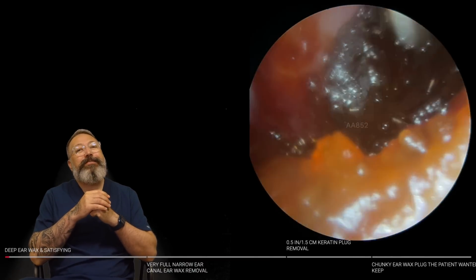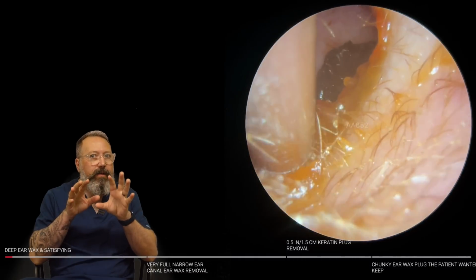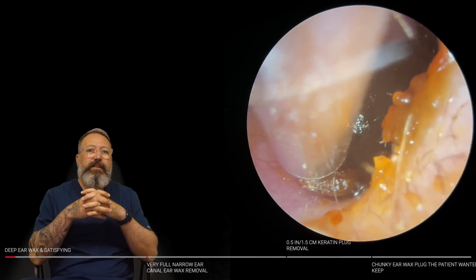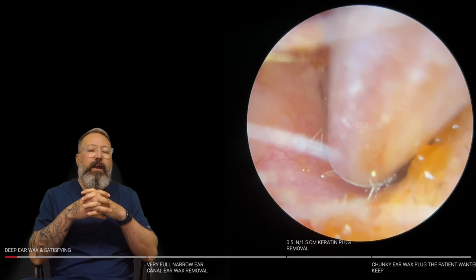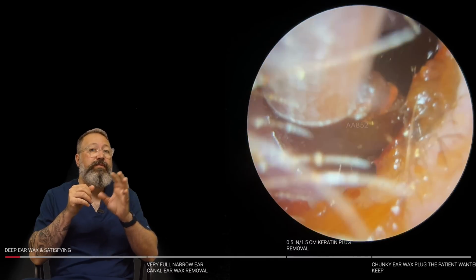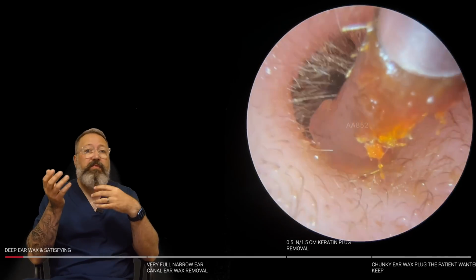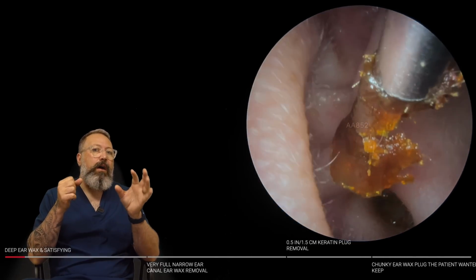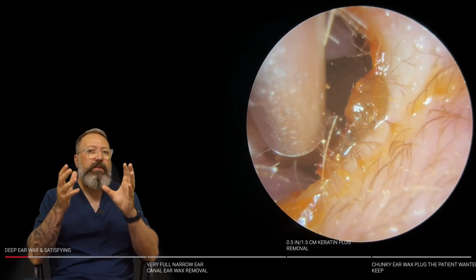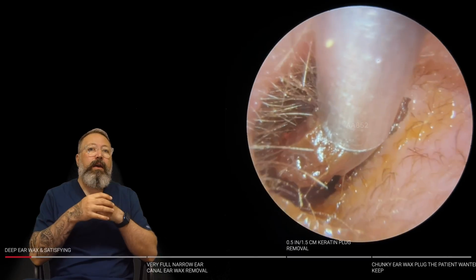There we go. So we can see in this particular patient, we've got this very, very deep, hard, dry, dark wax. Now it's just clearing this edge here. You can see it's a little bit sort of stuck everywhere really. The reason it's gone so dark in the center, a lot of people ask about the different colors of wax. It's usually an indication of the age of the wax a lot of the time, although you can get different colors, people just produce different colors anyway. But in this case, that's hard as well as being dark in color at the base, which means it's dried out a little bit, reacts with a little bit of the acidity of the wax, starts to darken in color, and that's what's happened here.